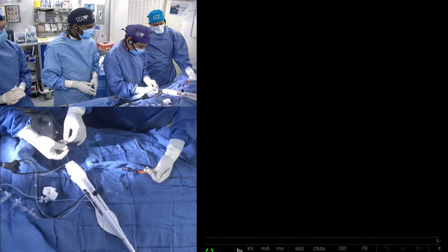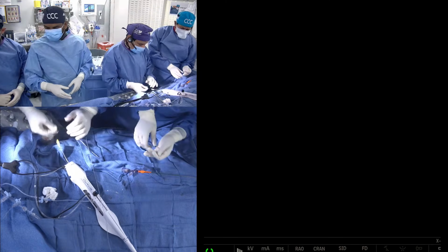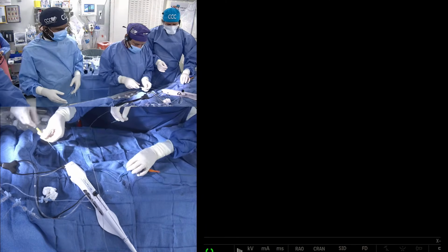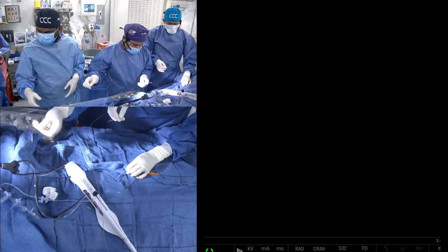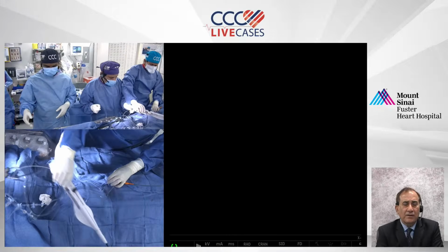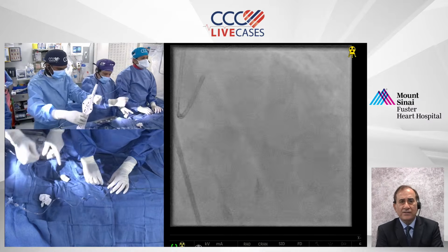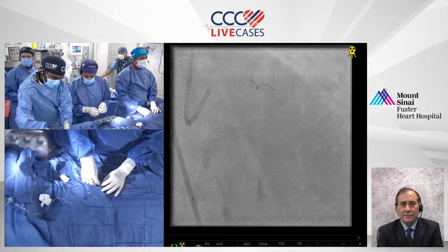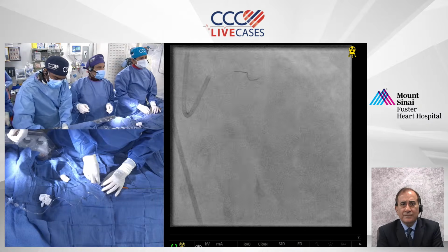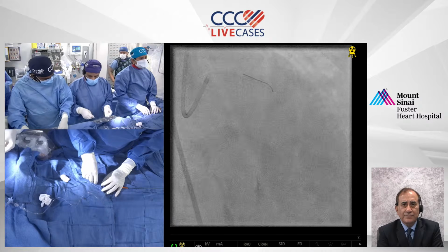So it is stuck. Okay, it was a worthy try. Look, I think it's important because people often encounter this, and these are some tricks. Now you pull the wire back and discard the equipment. I knew that was going to happen. You have to rewire since the wire is back again. You use the clip.